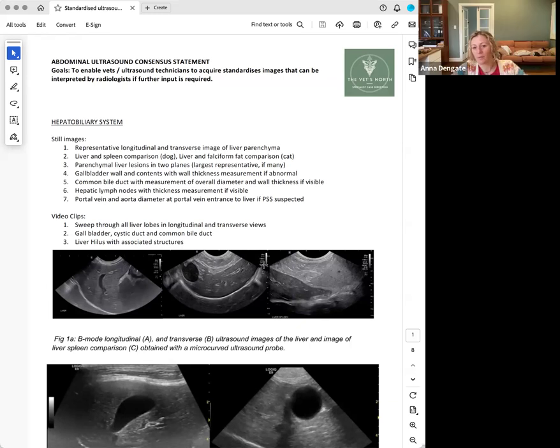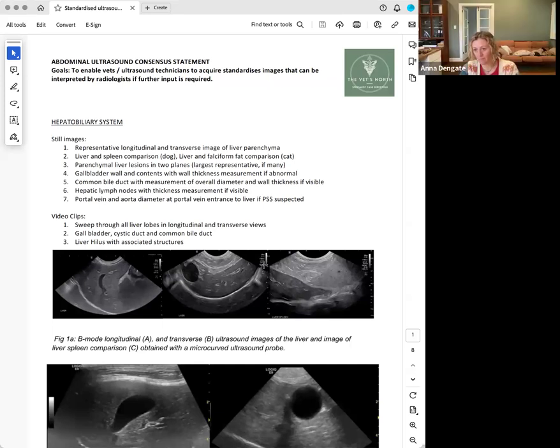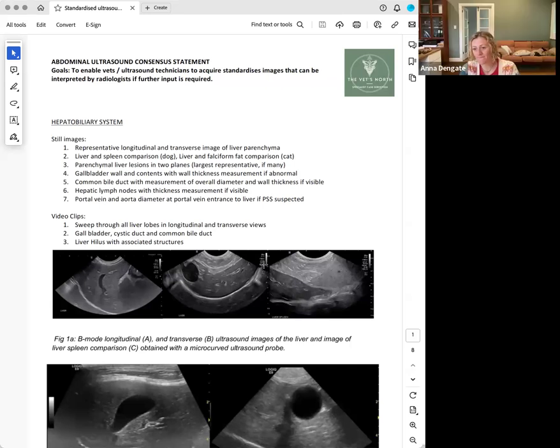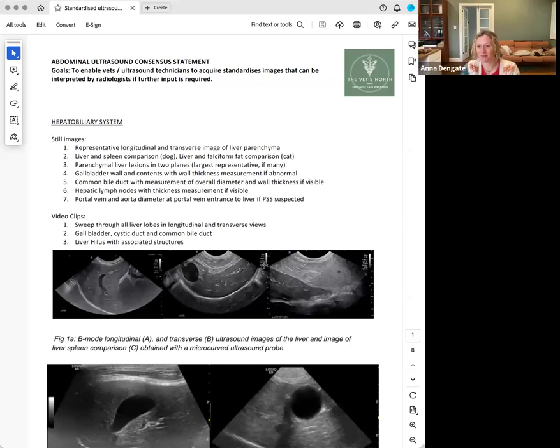Excellent. What are the differentials for a big liver? Broad differentials for a big liver. Metabolic disease, good. Neoplasia, inflammation, just broadly speaking. Yeah, there's one more. Congestion. Oh, yes. Zane's just been doing some reading on hepatic venous congestion, so I had to throw that in there. And he called it in a patient. I was like, yes, that was actually really perceptive.